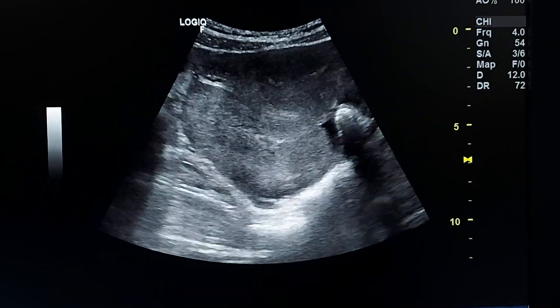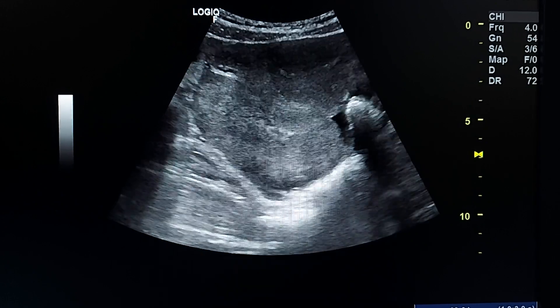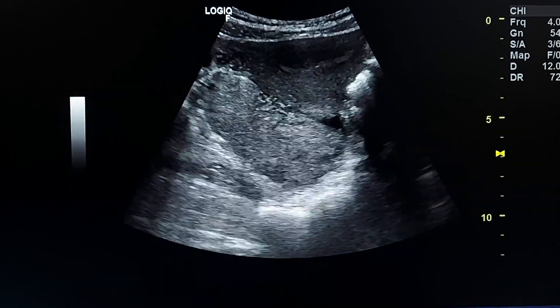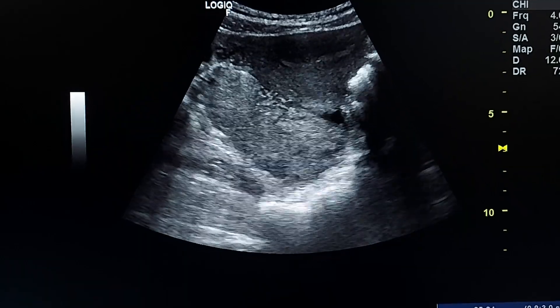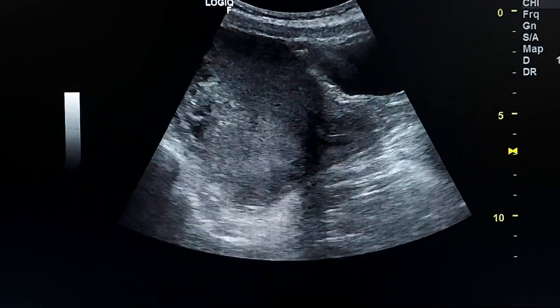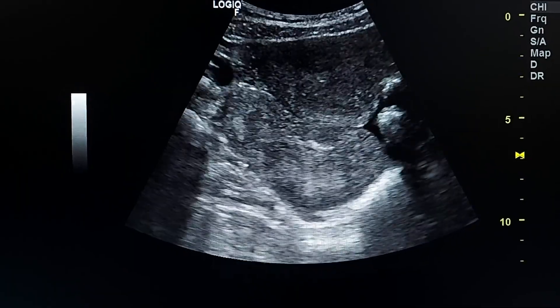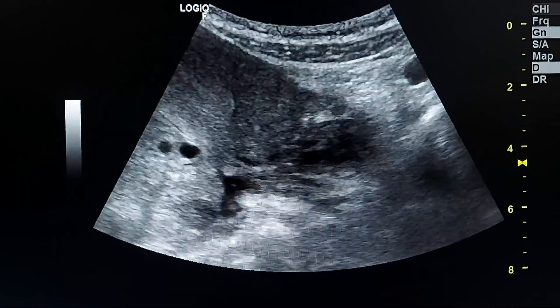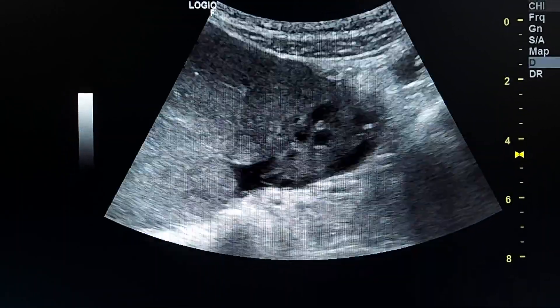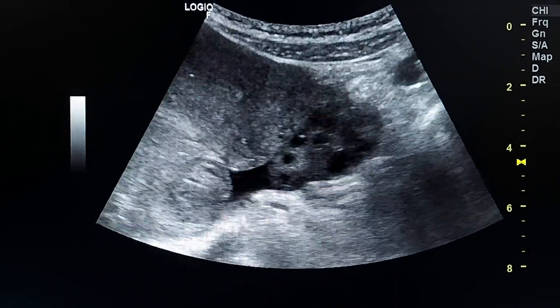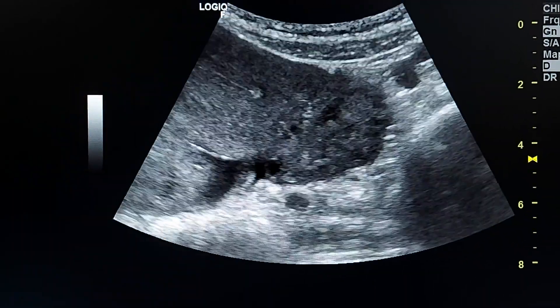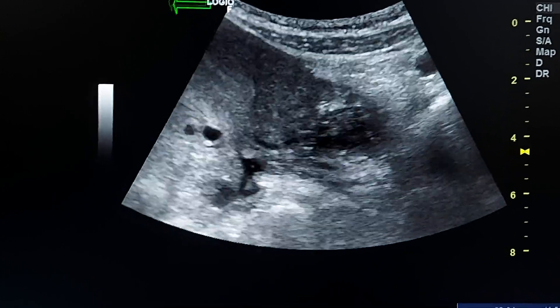This is an ultrasound case of right ovarian torsion. This is the right ovary, which is enlarged and echogenic, with small free fluid around it. This is the left ovary — by comparing the size, we can see that the left ovary is small, which is normal, and the right ovary is enlarged and echogenic. We can compare the echogenicity between the two.